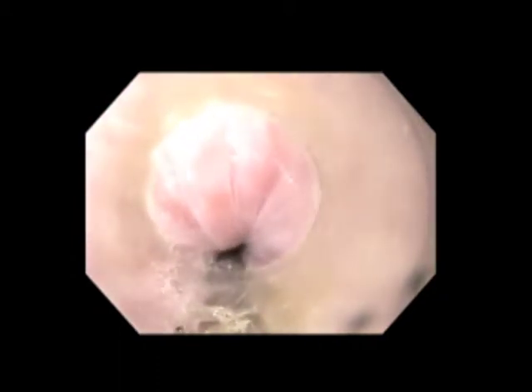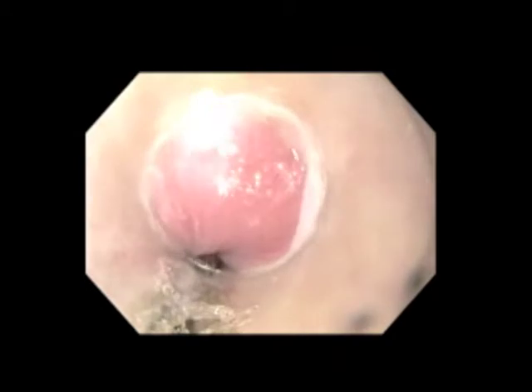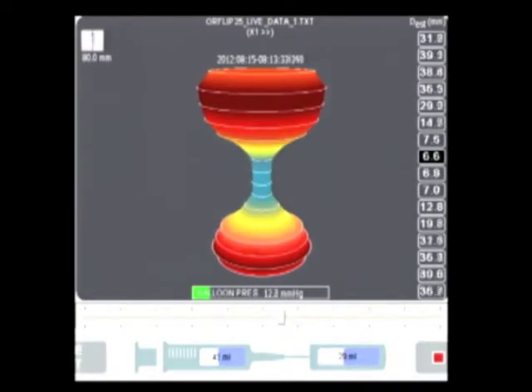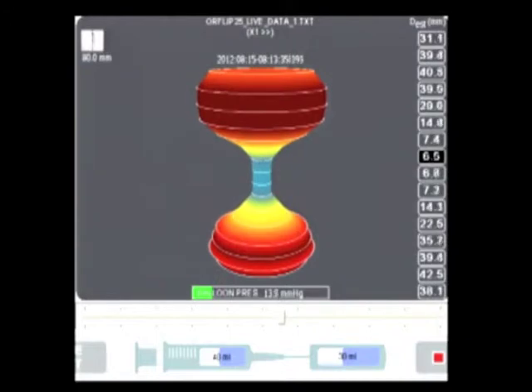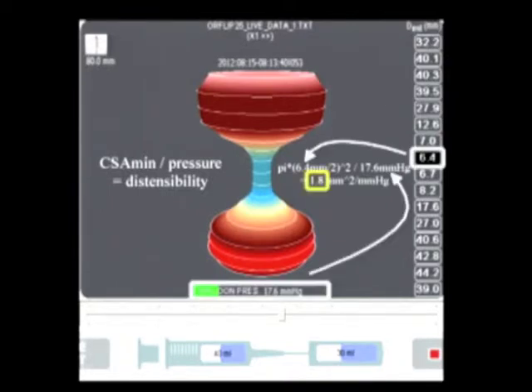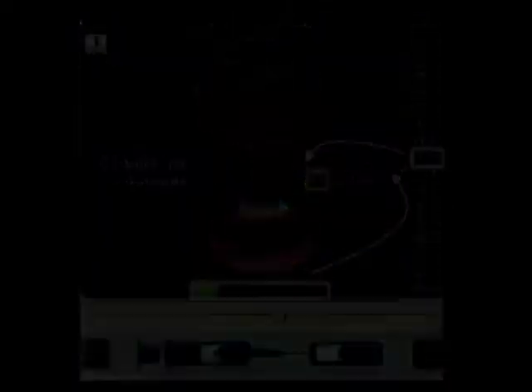After initial endoscopy to clear the esophagus and stomach, a functional lumen imaging probe, or FLIP, is placed across the EGJ. The FLIP probe consists of a catheter with a variably inflatable balloon at its tip. Impedance planimetry is used to measure cross-sectional areas at 5 mm intervals along the catheter to create a graphic reconstruction of EGJ anatomy. The primary outcome measure of distensibility is calculated by dividing the minimum cross-sectional area, or narrowest point at the EGJ, by intra-bag pressure. This patient had a pathologically low distensibility of 1.8 at the start of his procedure.